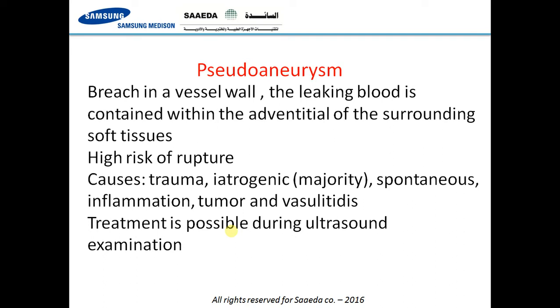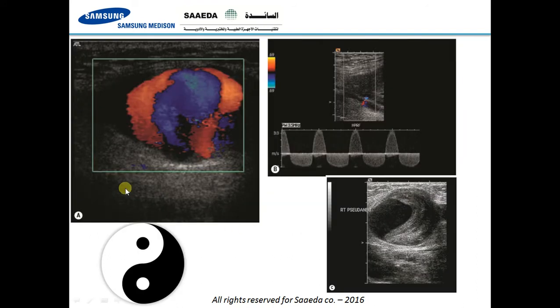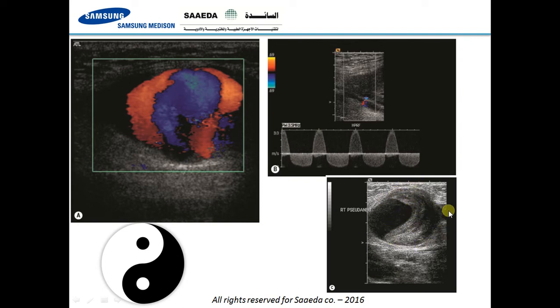If the pseudoaneurysm is fresh — less than one week — it is often possible to treat it non-invasively with ultrasound. You can see here the typical yin-yang sign: blood going in and out of the aneurysm sac with no discernible wall. When you remove the color Doppler, you can see a partial thrombus formed within the lumen of the aneurysm.